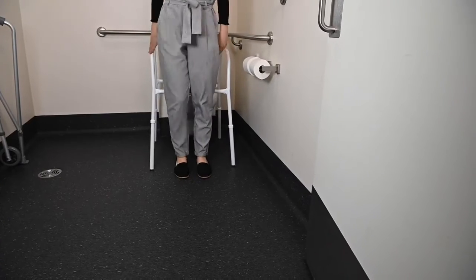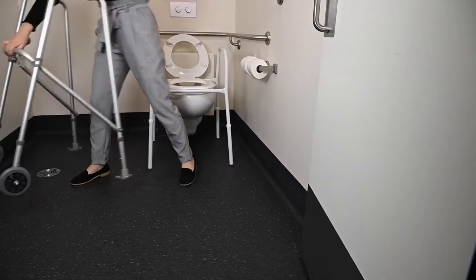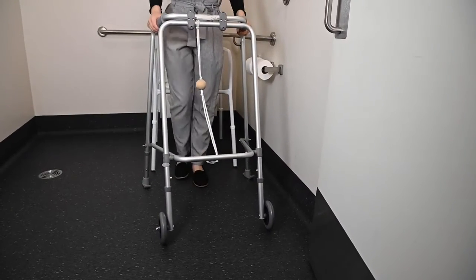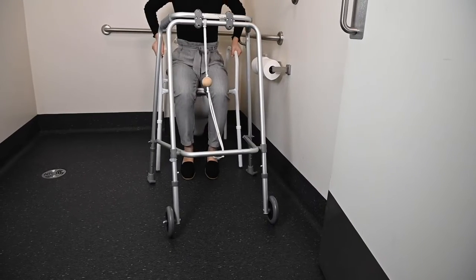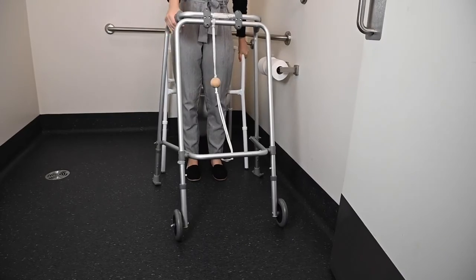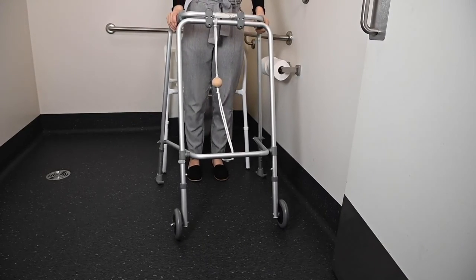If you use a gait aid, it is important that you use the armrests of the over toilet frame to push down when transferring. Once standing, you can then transfer your hands from the over toilet frame to your gait aid. The gait aid is only to be used when mobilising and not when transferring.